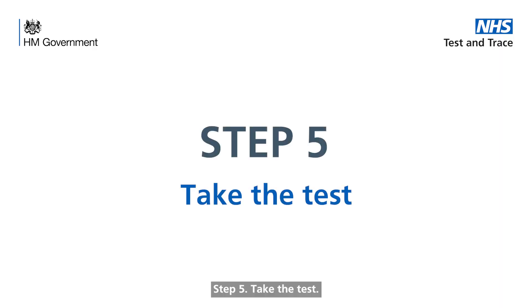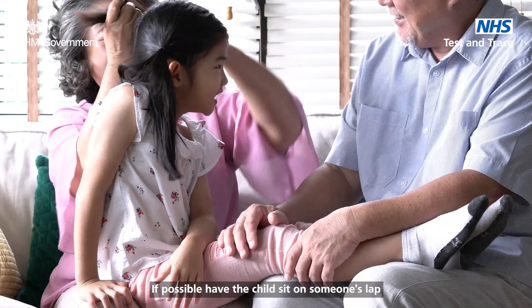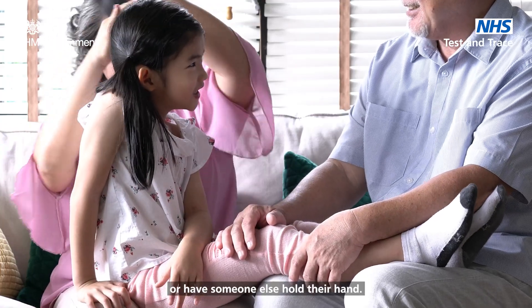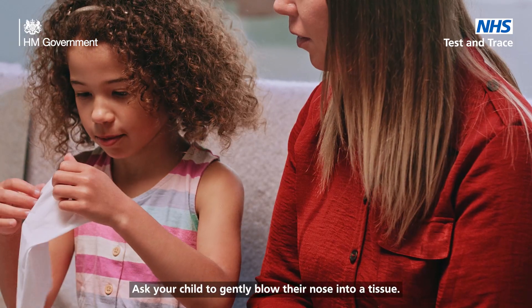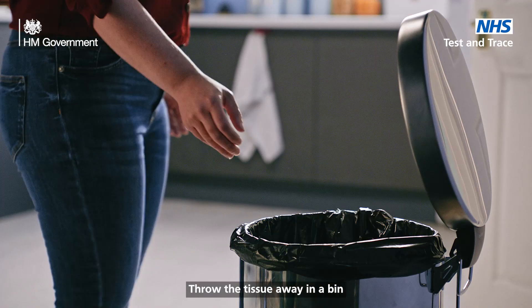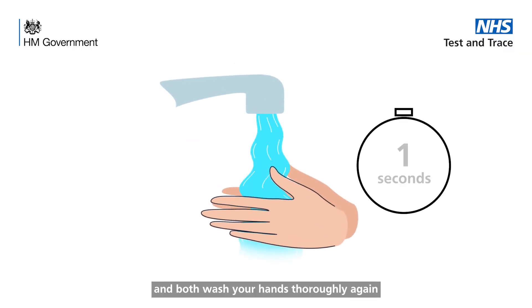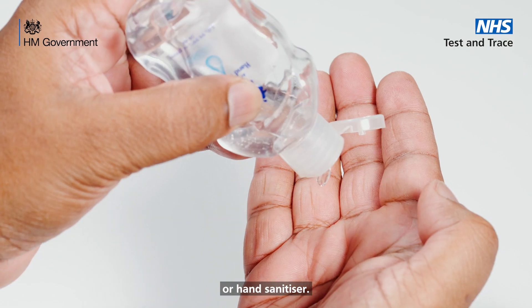Step 5. Take the test. Make your child comfortable and secure. If possible, have the child sit on someone's lap or have someone else hold their hand. Ask your child to gently blow their nose into a tissue. Throw the tissue away in a bin and both wash your hands thoroughly again for 20 seconds using soap and warm water or hand sanitiser.